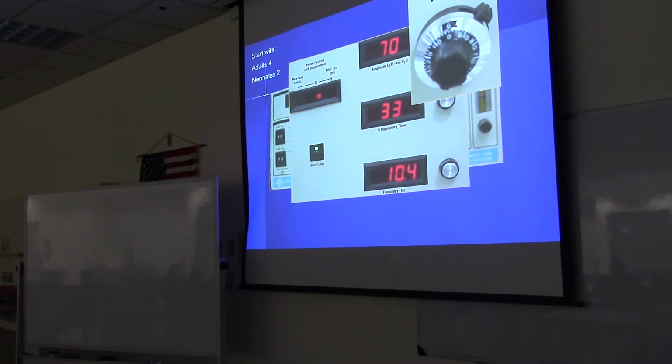All right. Some of the stuff you're telling me that I don't know, and I didn't realize that. I knew that to judge high frequency oscillation, you look at chest wiggle. So now that they're doing it with jet ventilation, I wasn't aware of that. So, yeah. Go ahead, share whatever you learn. Please share it with me. This stuff changes so frequently.